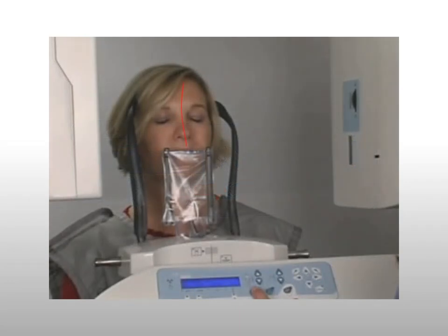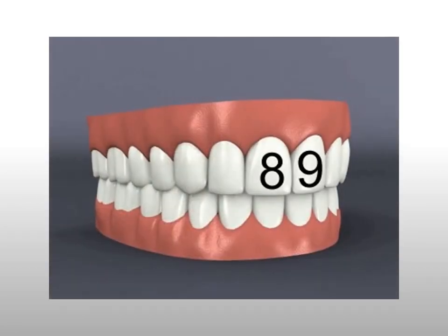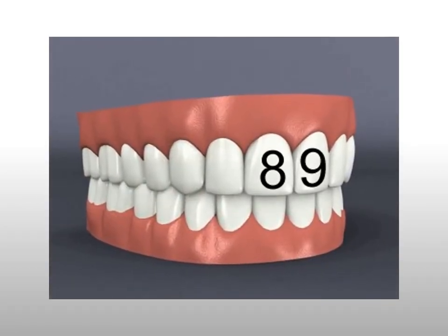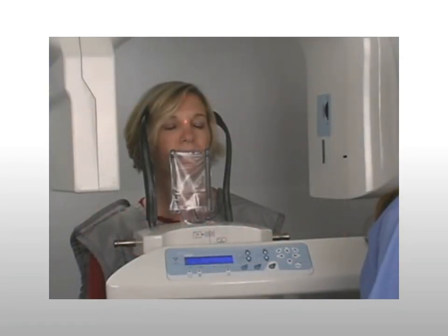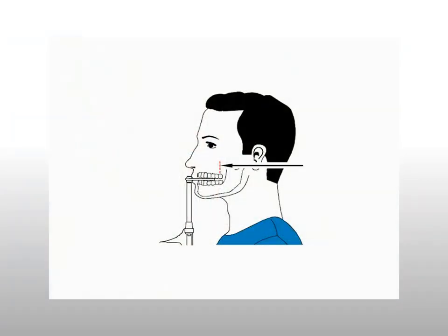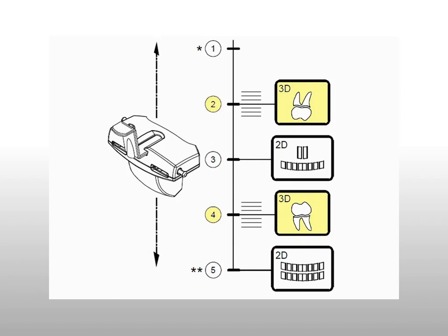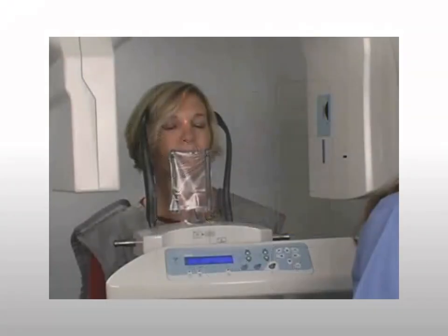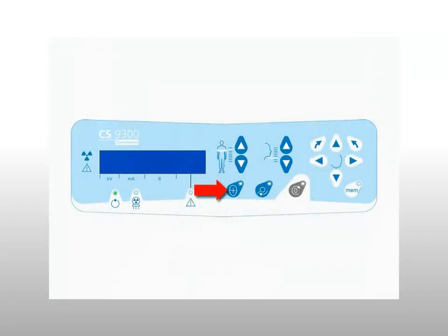Use the mid-sagittal laser to center the patient and the machine — the laser should run straight down the patient's midline, with teeth 8 and 9 as your guides. Use the center of rotation laser to check the center of the area of interest. Adjust the 3D field of view laser, if needed, to focus on either the maxilla or the mandible. Adjust the patient's head using the lasers to guide you. If you need additional time, press the laser beam button again.